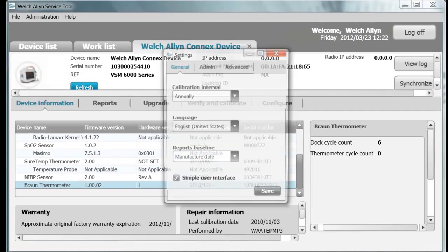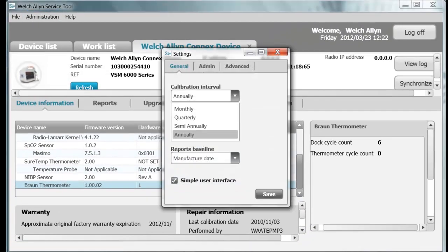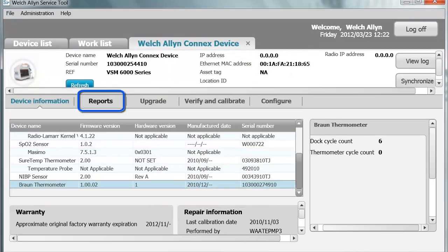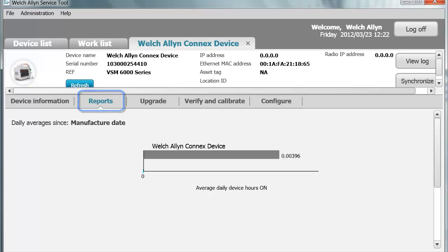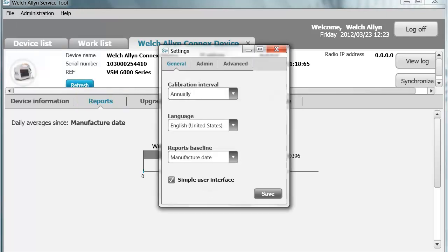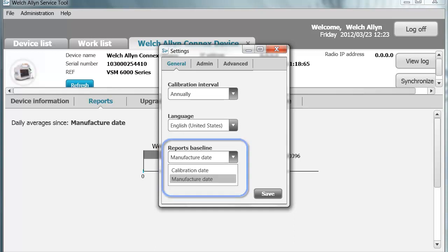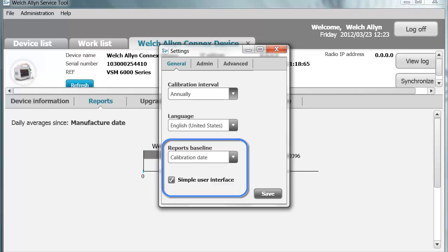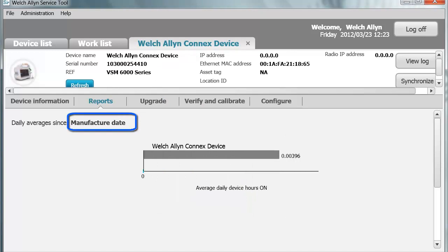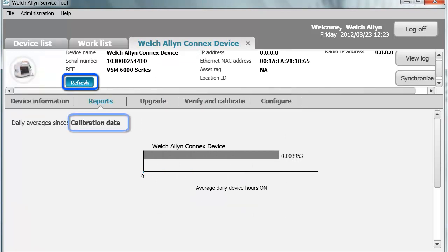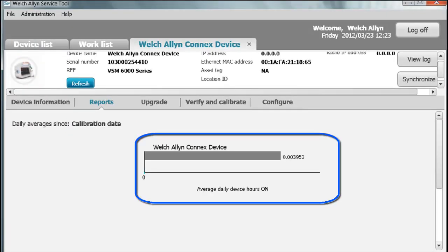If you go to Admin, Settings, you can change your calibration interval to monthly, quarterly, semi-annually, or annually. Welch Allen currently recommends checking this device on an annual basis. Next, go to the Reports tab by clicking on Reports. This provides the daily averages since the manufacture date. Under Settings, Reports, Baseline, you can change it to the last calibration date or the manufacture date. When you refresh, it changes over to calibration date. This shows the device daily average power-on time and the NIBP cycles per day.